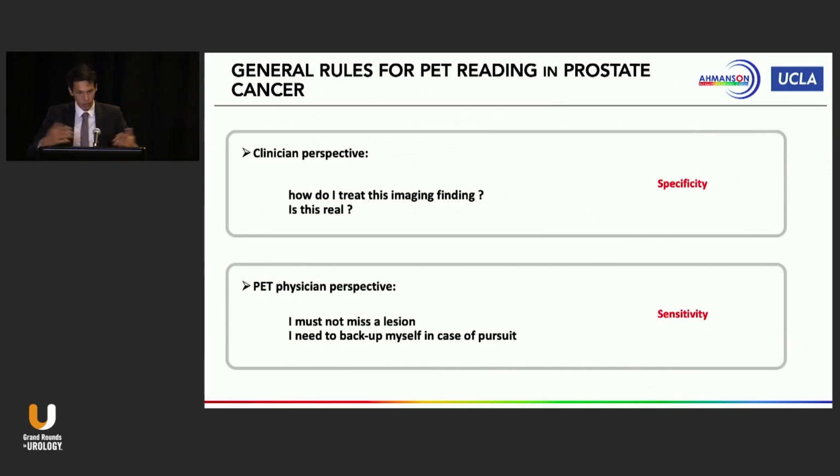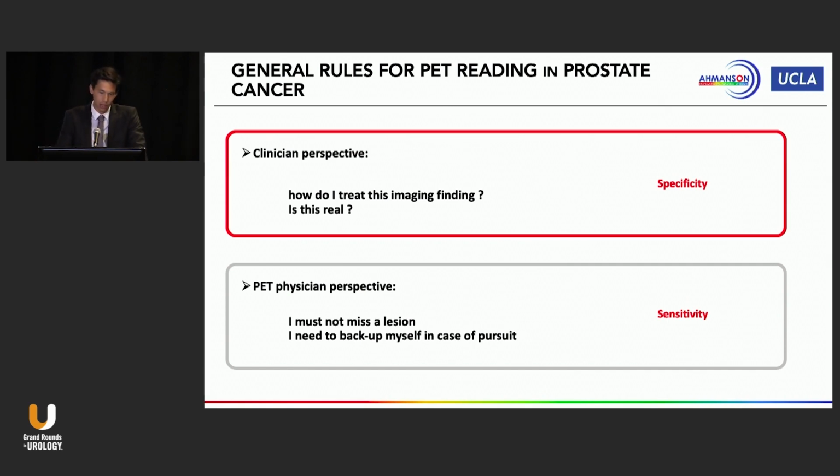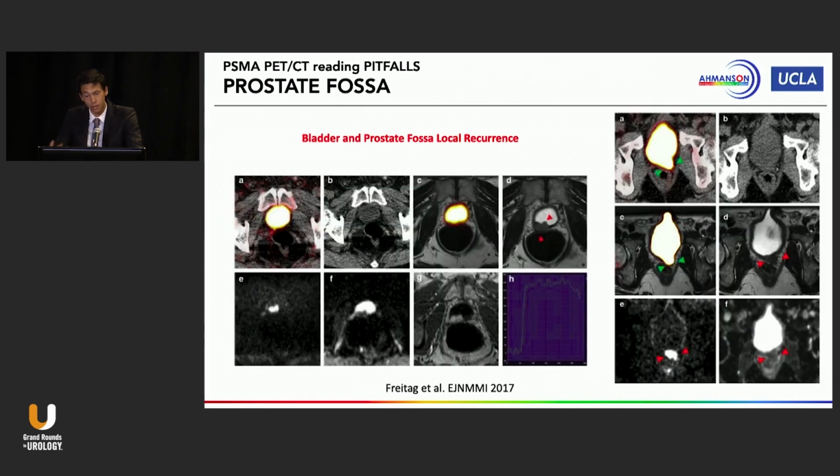I think here we deal also with a more general paradigm: the difference between the treating clinician and the imaging doctor who is doing the report. The clinician will act based on the report, and he needs specificity to be sure that what is described is actually disease. But when you read 30 scans a day as the PET-CT reader, you just do it systematically, you have to describe everything, and you don't want to miss a lesion. So this is just part of medical art. Of course, in the end, what really matters is probably the clinician perspective. But one way to sort this out is to communicate directly between the urologist and the PET-CT report doctor. It usually helps a lot, as does putting these cases on tumor boards. But I think this will always happen. It will never go away for any medical technique, even in 100 years from now. There will always be some discrepancies like that. We just have to acknowledge it and be aware of it.